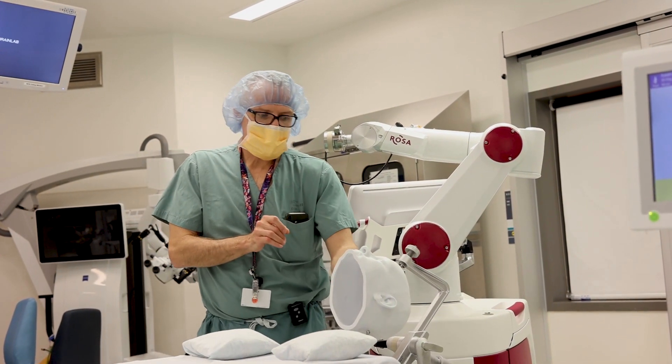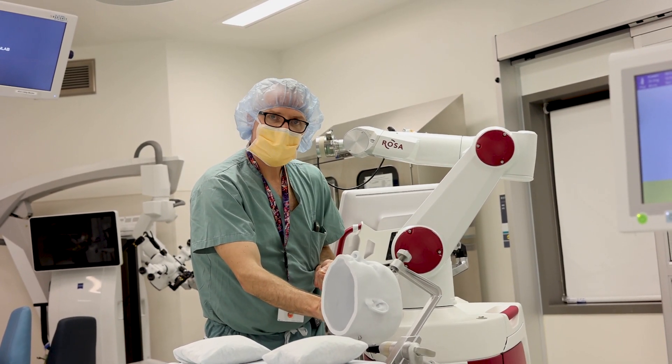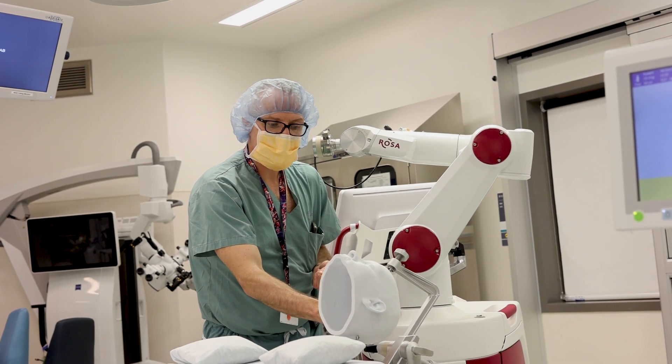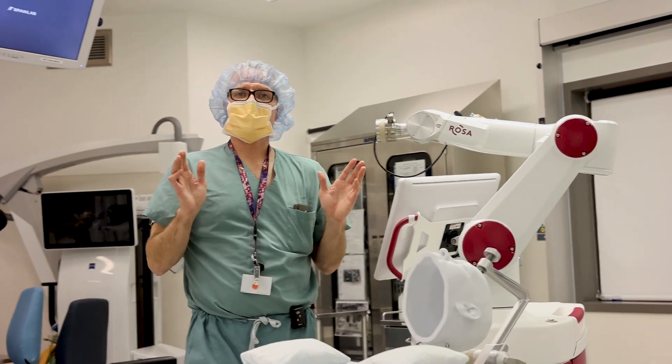We take the stylet out, we pass the electrode in with 10 to 15 contacts in it, and we screw it — it has a little cap — into the anchoring bolt. We screw it in and then we're finished with the first electrode.